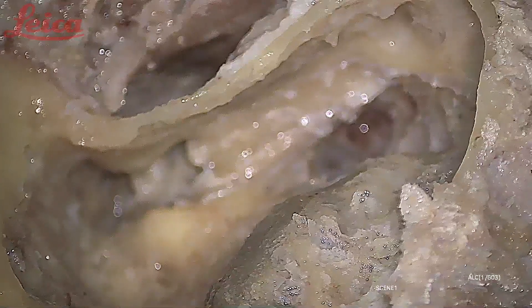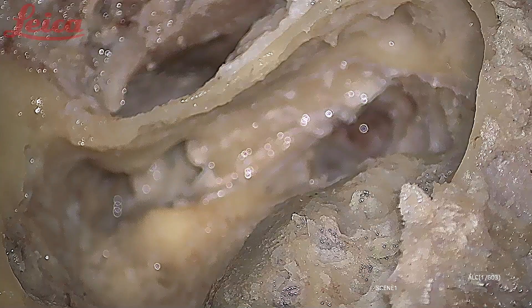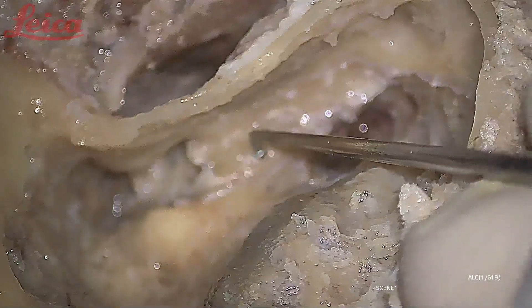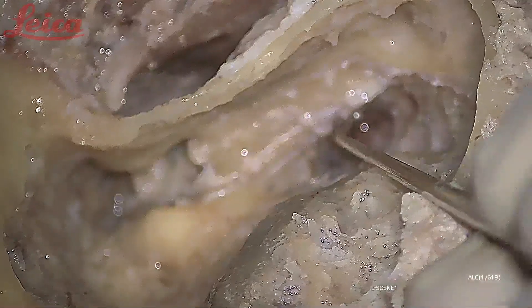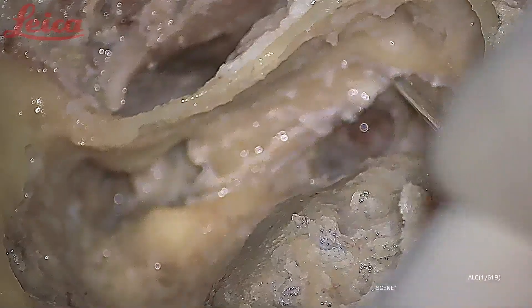Regarding facial nerve decompression — is it important to decompress the entire extent, or just the focal area where pathology is? The area which is involved should be decompressed, but a little bit of the normal nerve has to be decompressed both distally and proximally so you give the nerve room to expand. Decompress about one centimeter proximally and distally, and incise the sheath up to there, so the pressure spreads out evenly and results will be better.